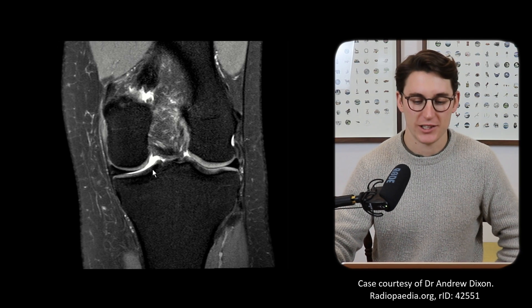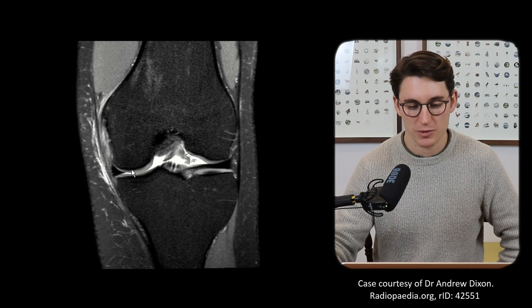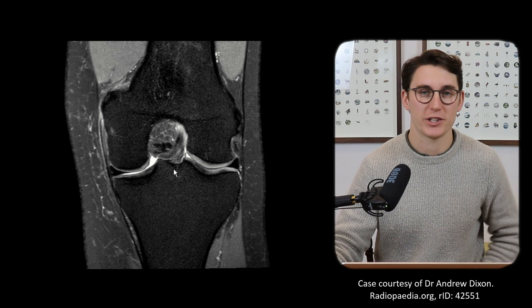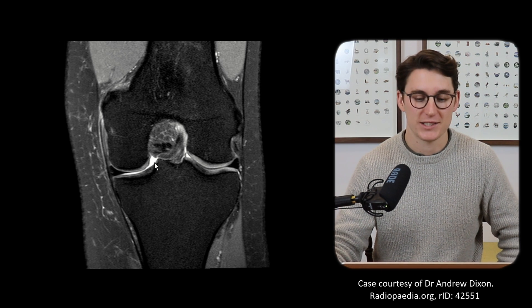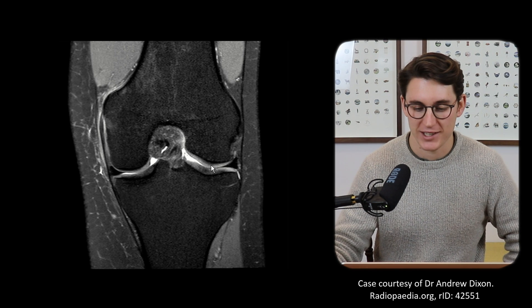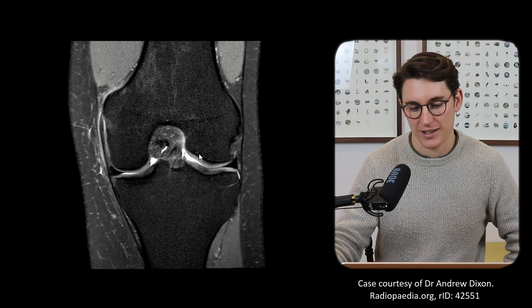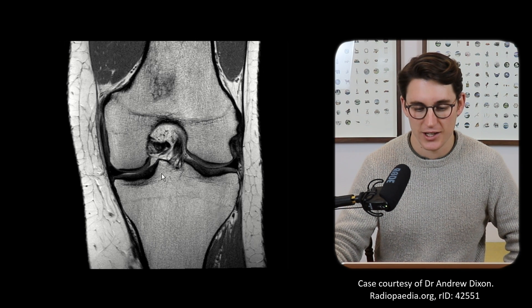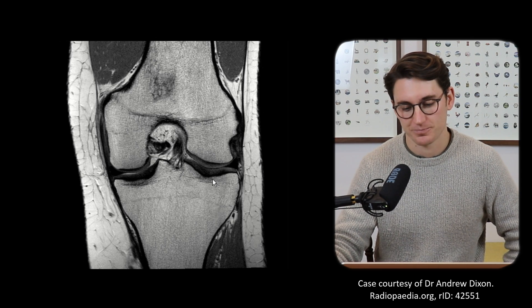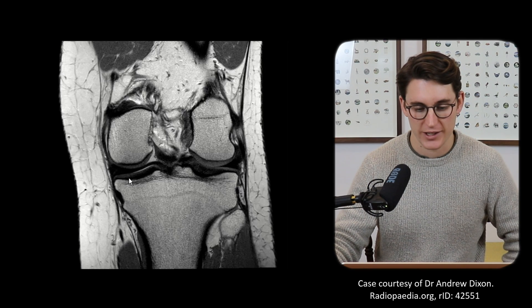While we're here, let's look at the articular cartilage. Scrolling through the medial articular cartilage of the femoral condyle, we want to make sure the cartilage is not disrupted — no bits of cartilage broken off — and we can also look within the joint space for any intra-articular bodies, which may be signs of loose bone or cartilage fragments. We want the cartilage to maintain its thickness and be nice and smooth. The black line underneath the cartilage — more visible on our coronal images — is not cortex as we would call it further up; this is our subchondral bone plate. We also want to maintain the integrity of cartilage on both tibial plateaus.